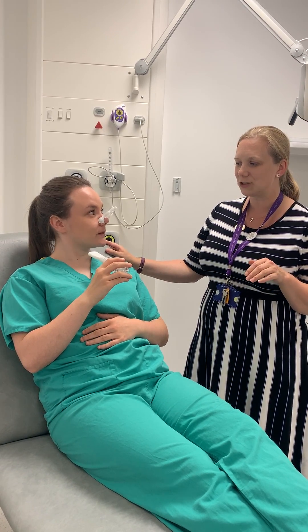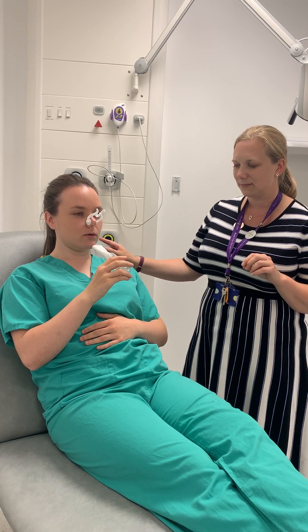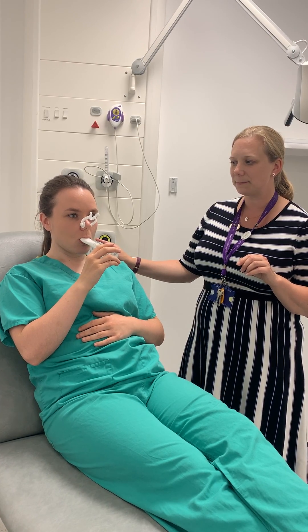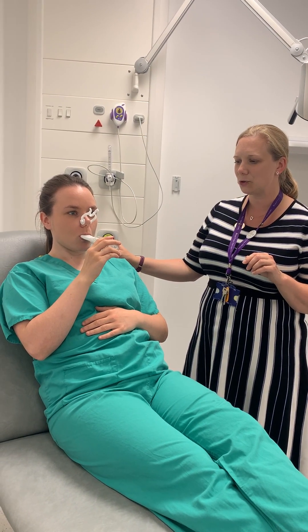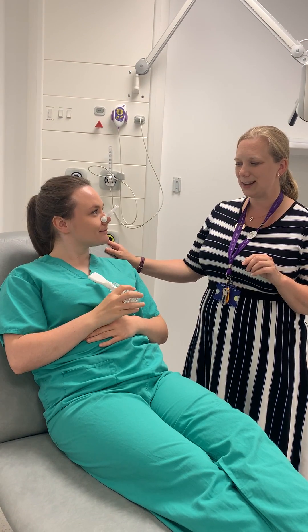And you're not feeling dizzy or lightheaded at all? Good. Would you do one more? Deep breath in, all the way in, keep those shoulders relaxed. And relax. Brilliant, well done.